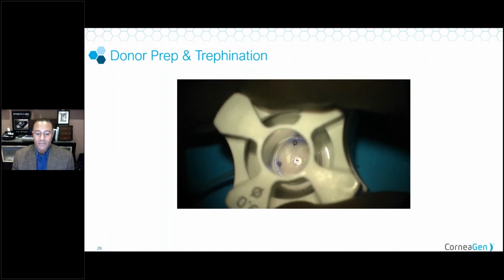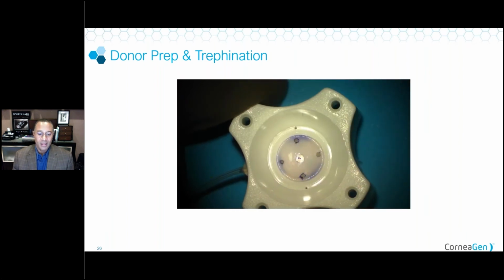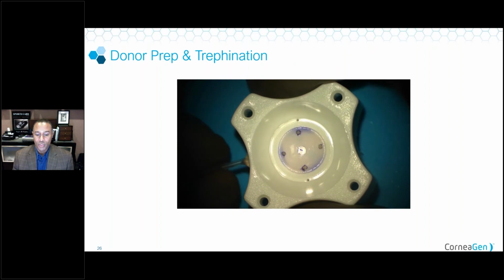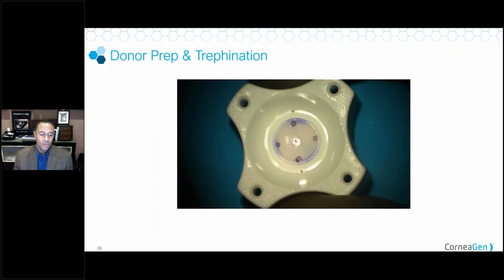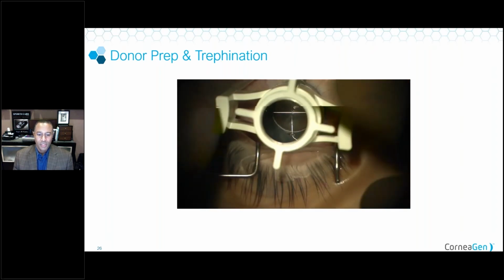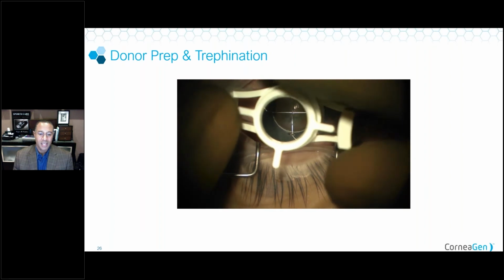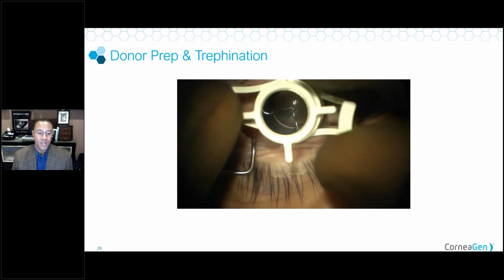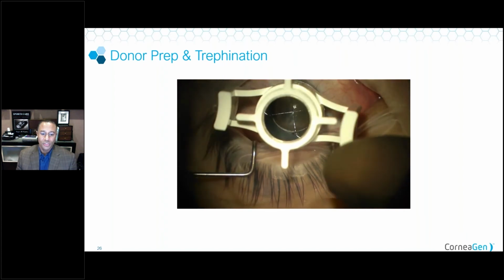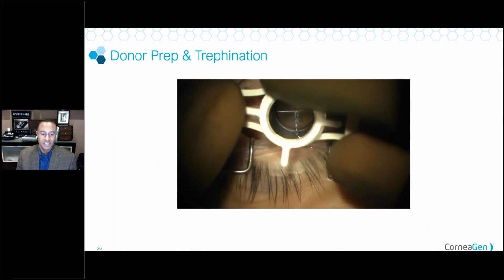If I'm doing a very, very steep cornea, then I might not even punch the cornea out and take it as is, just laying it on top. After we've applied suction, our marks will transfer over to the donor, and then we'll remove that suction tubing so it doesn't get snagged on something and then pulled off the Mayo stand accidentally. Put the cover on, no need for BSS on top of that because we don't want to induce any swelling in our donor. We go back 3/4 turns to our flush point, which brings us to 0.